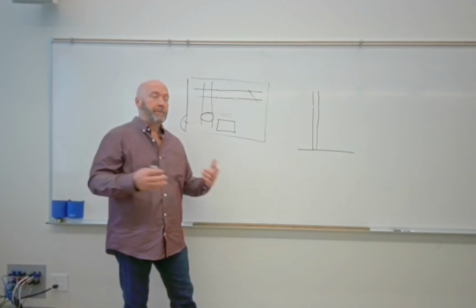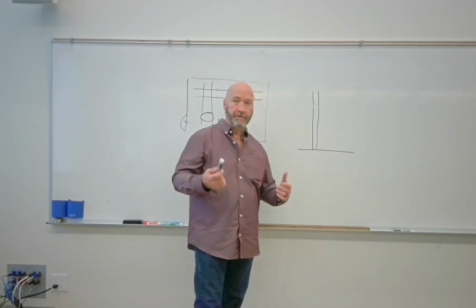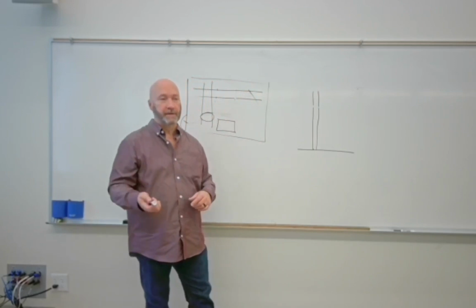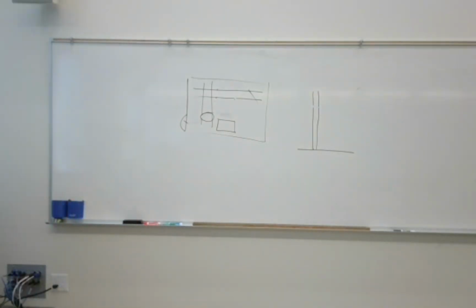C-arms, we also use them in portable fluoroscopy. If you've ever been back to special procedures, interventional, they use a C-arm system as well. There's this fluoroscopy. What you're going to see over at Azalea is not fluoroscopy. It's just diagnostic. So those are your support systems. You have ceiling, floor mounted, and C-arm systems.